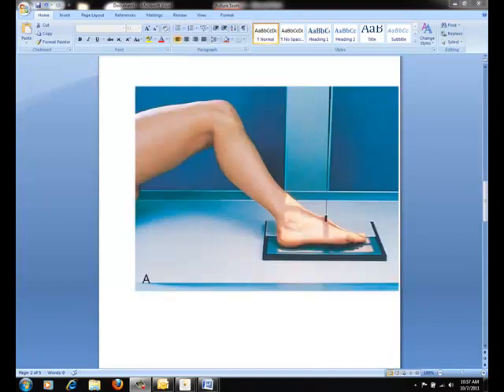You are now ready to position the patient for an AP oblique projection and medial rotation. The medial oblique is preferred over the lateral oblique because the plane through the metatarsals is more parallel to the IR, and it also opens the lateral side joints of the midfoot and hindfoot better.